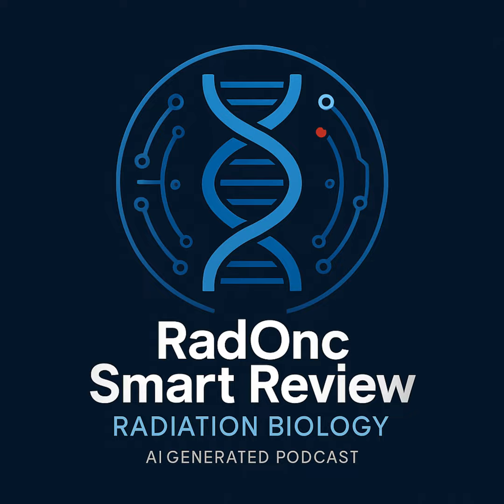Got it. So those HU values help us identify tissues, and they're absolutely critical for dose calculations, especially when you're dealing with things like lung or bone where the density varies a lot. Couldn't do modern radiotherapy planning without them. Now, sometimes the natural difference in density between tissues isn't quite enough to see what we need to see clearly. Yeah, like trying to see blood vessels or specific organs well.